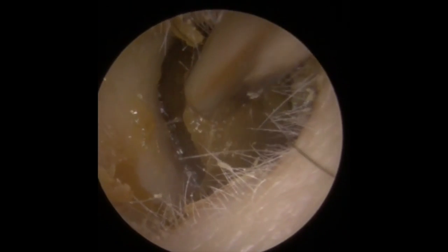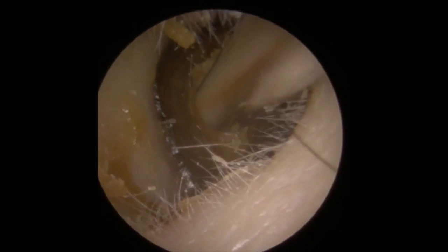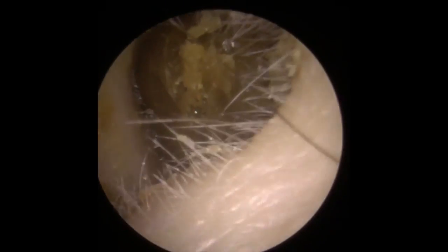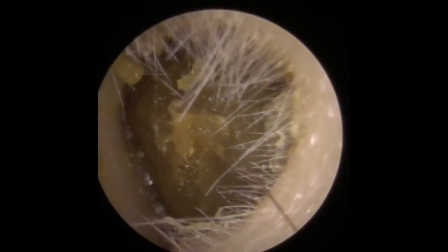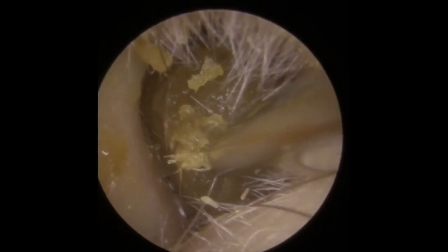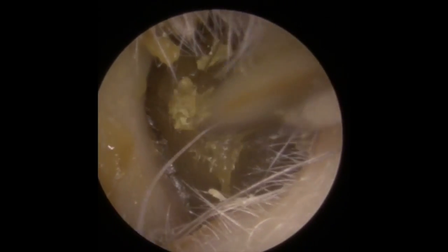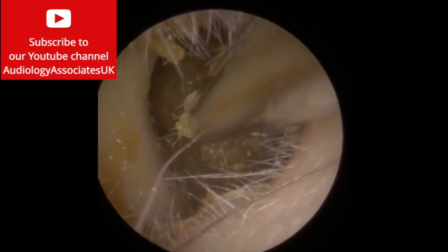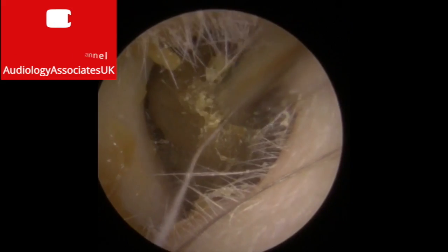We're using the standard sizes on the tube to loosen the wax from the canal wall, which lifts it, and allows us to start pulling away chunks from there and hopefully try to get it away in a larger piece. You can see the wax itself is quite sticky and quite stretchy, so we need to really maneuver this wax away from the ear canal walls. If we can take it from this right side canal wall, we'll probably be able to bend it out and away from the canal.